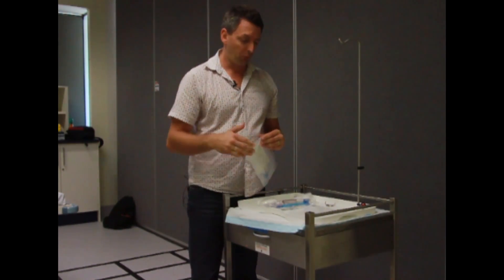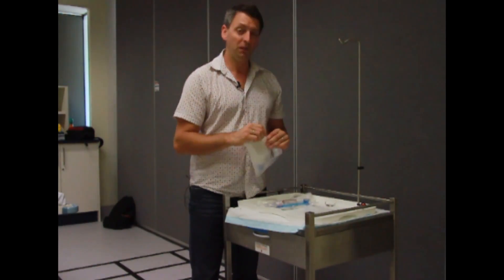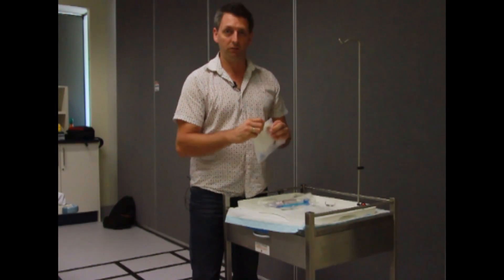Now that was how we prime a gravity fed line. There are many types of pump lines available, but I'm just going to show you one just to demonstrate.